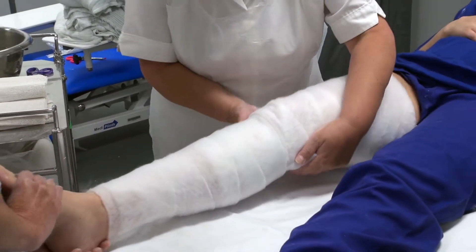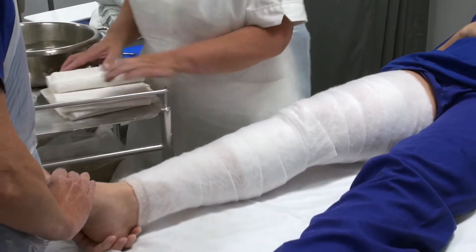Put your leg down — just lift, just stop, that's it. Put your leg down. Okay.